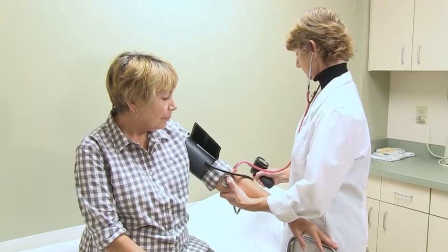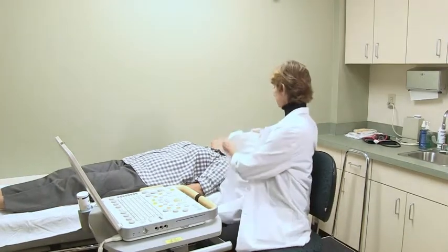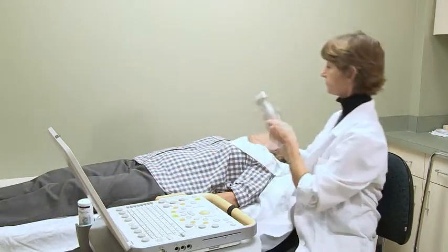You will then be asked to remove any necklaces and lie down on a comfortable exam table. The technologist will tuck a soft towel around the collar of your shirt, place a small amount of warm water-based gel on your neck, and begin scanning.